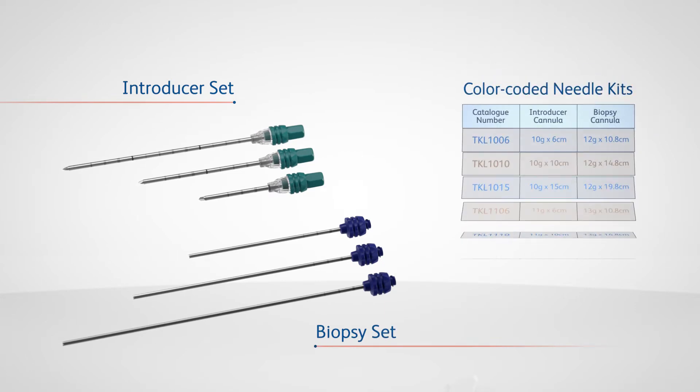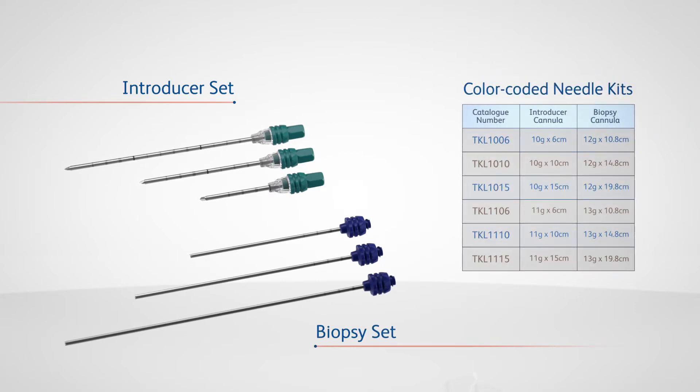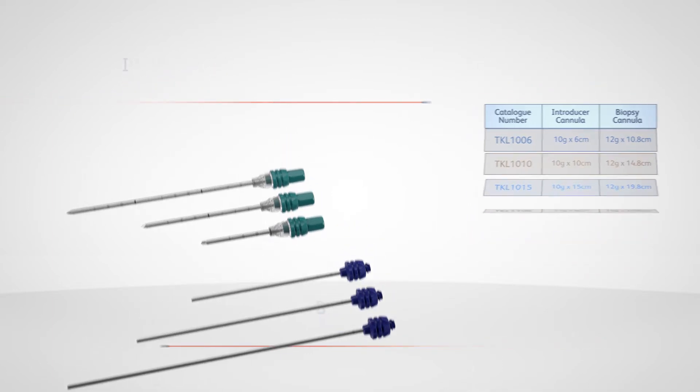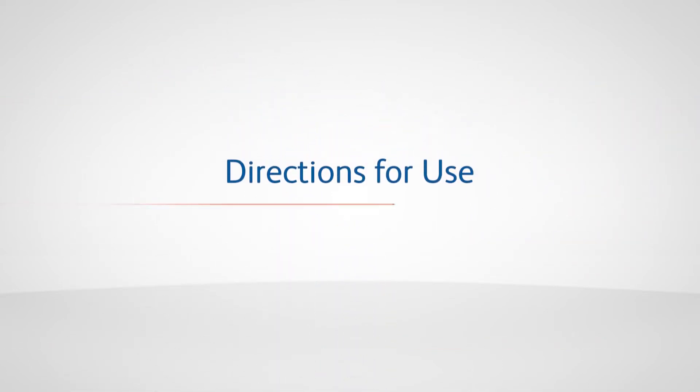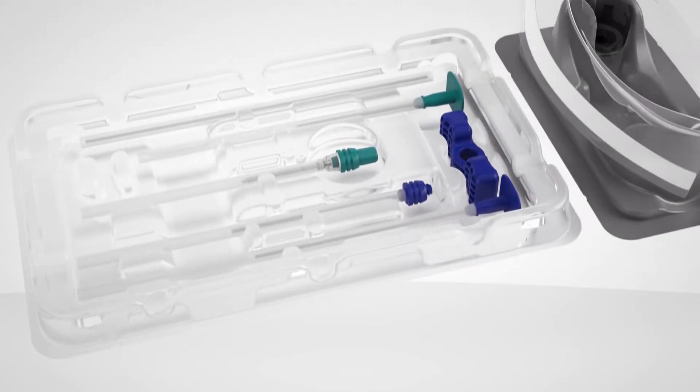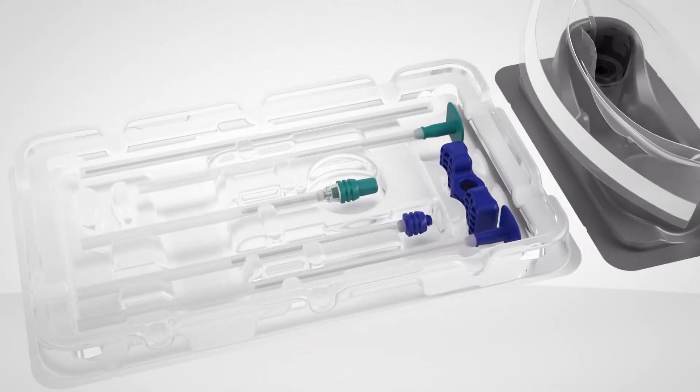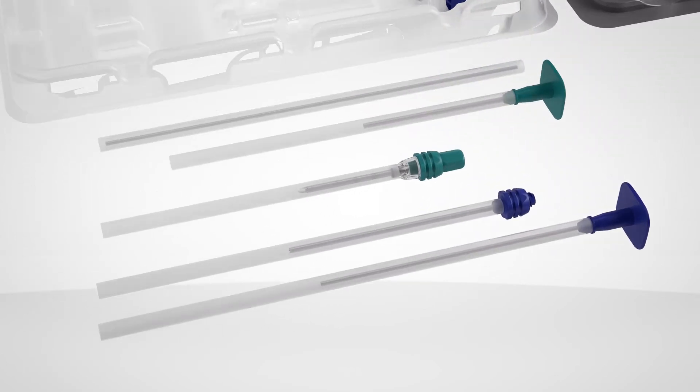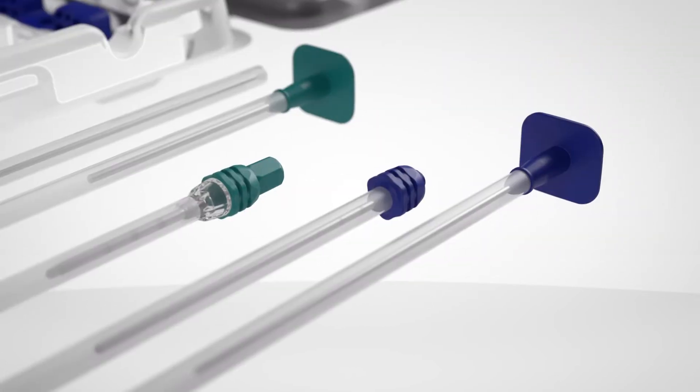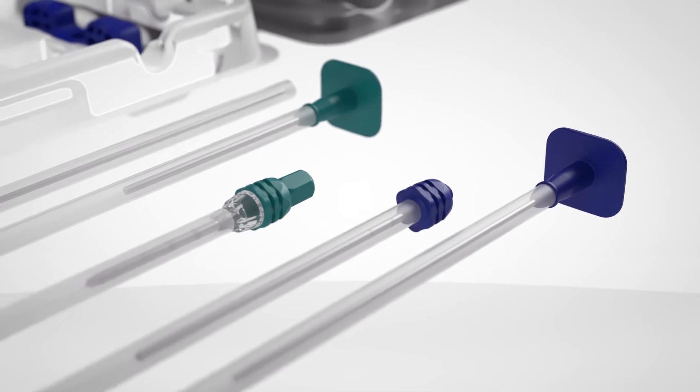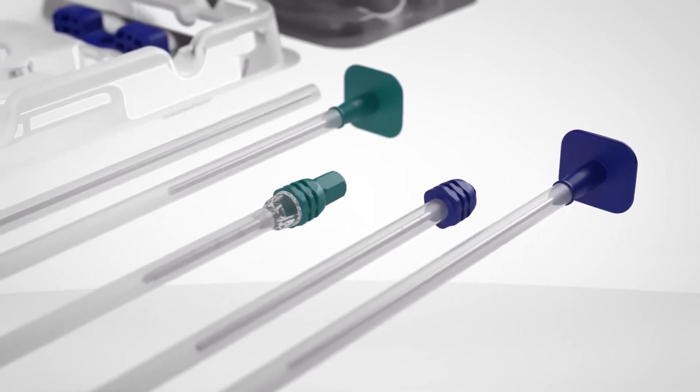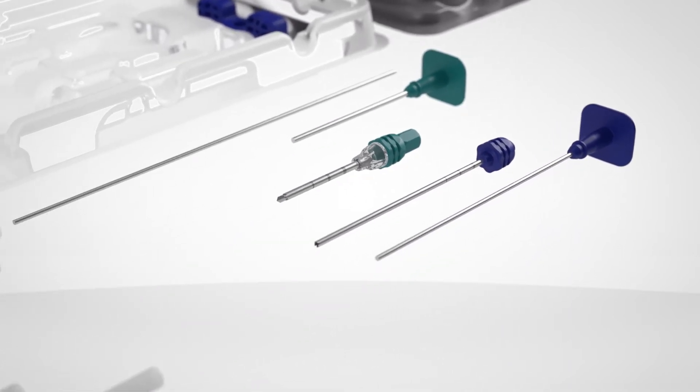Color-coded for easy identification of introducer and biopsy sets. To begin a procedure, remove the needle components from the package using aseptic technique. Inspect each needle for any issues that might impair proper function and remove the protective needle sheaths.